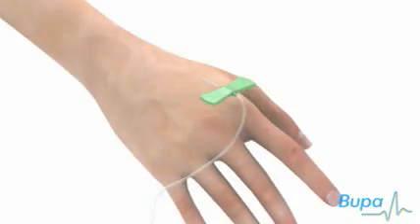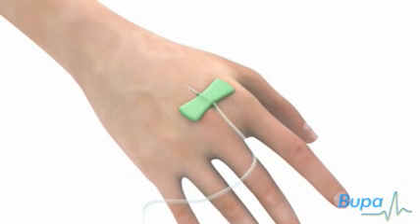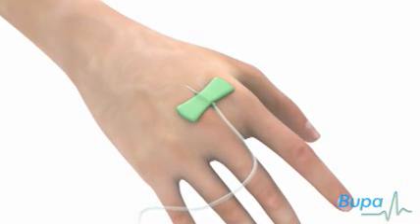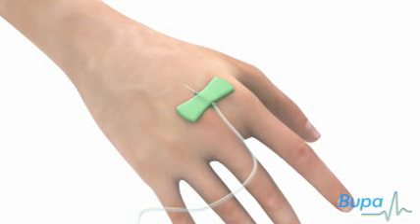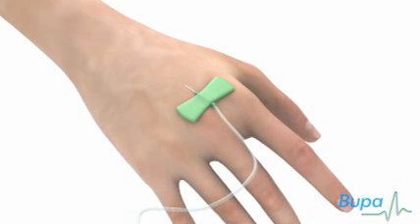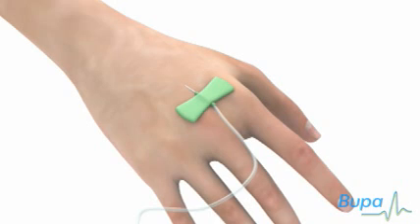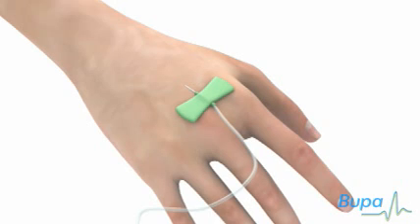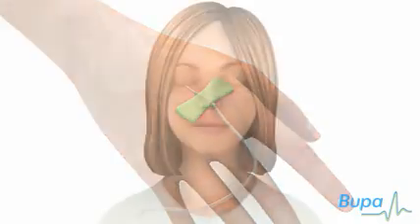Your child will be given a general anaesthetic. This means he or she will be asleep during the operation and feel no pain. Here we show the anaesthetic being given.